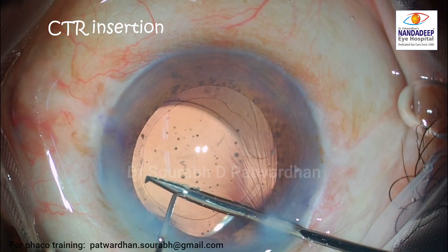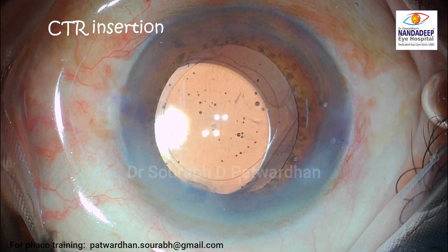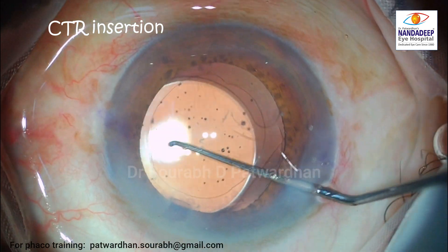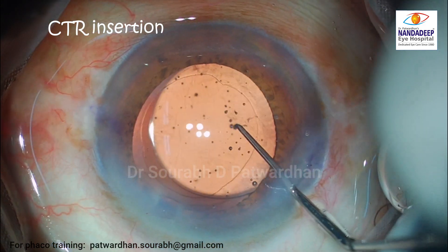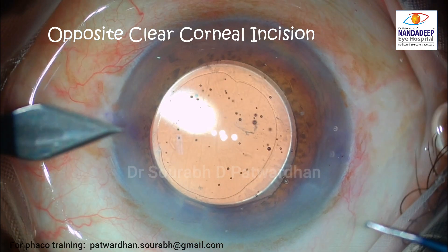As a retina surgeon, I have noted that if the IOL-bag complex has decentered or subluxated and the eye has a CTR in place, it is very easy to fix the same CTR-IOL-bag complex later with just suturing. You can put the CTR even before the IOL implantation — in this case, I implanted it afterwards.